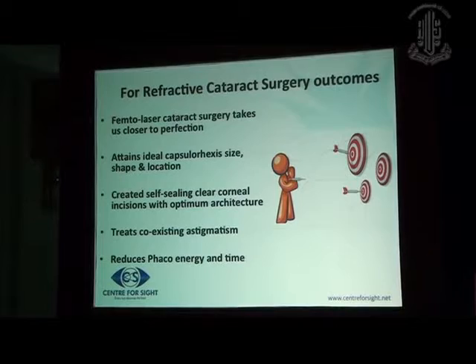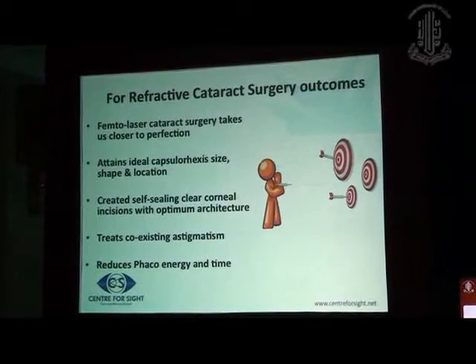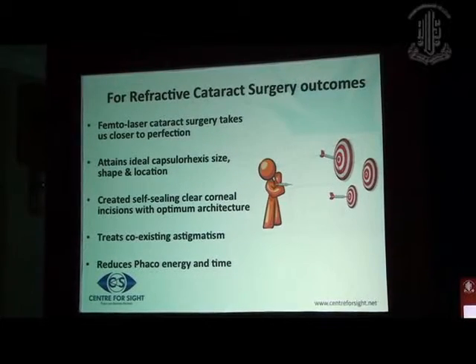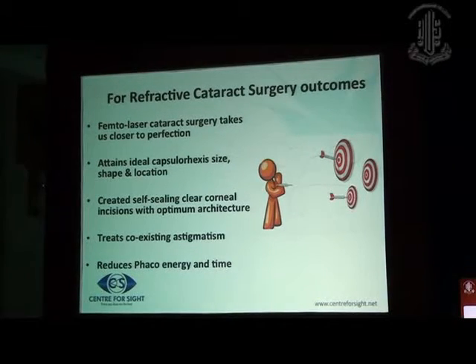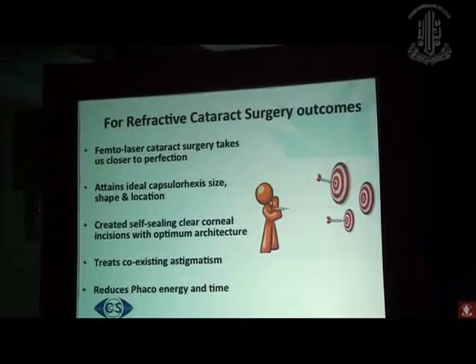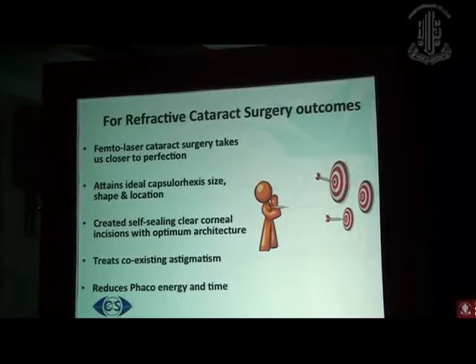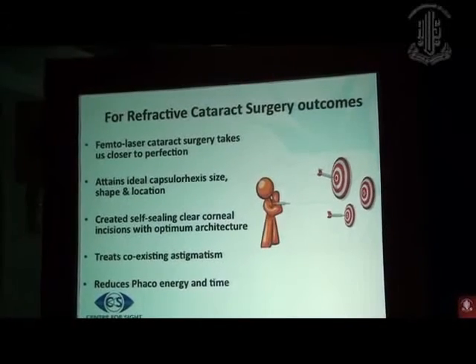The nomograms are pretty standard, and you can work on these nomograms because it is real time in vivo OCT that you are getting. You are able to work at precisely the thickness or the depth that you want the cut to be, and you get excellent results. And to top it all, the icing on the cake would be that soon we will have the flap that will be available with the LensX system. So you could have an OCT guided flap for the femto LASIK that can be created within this single machine.